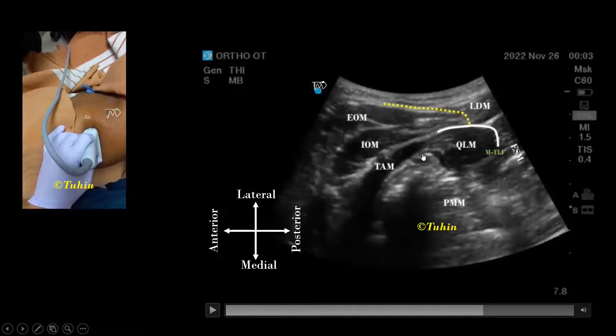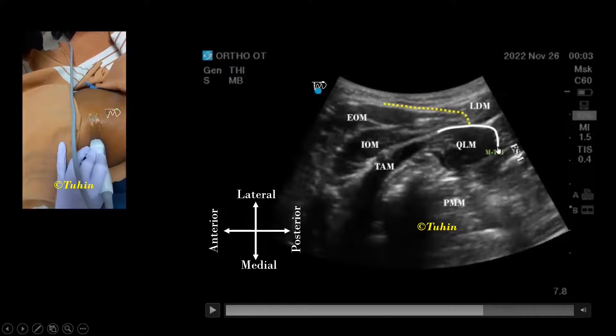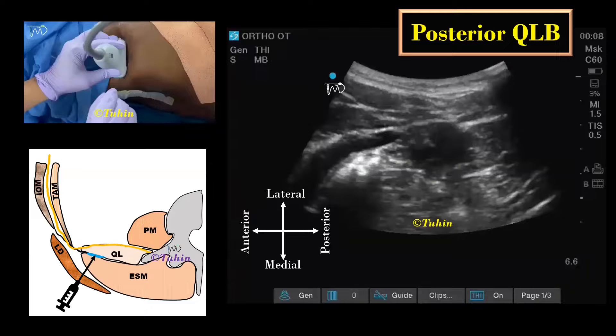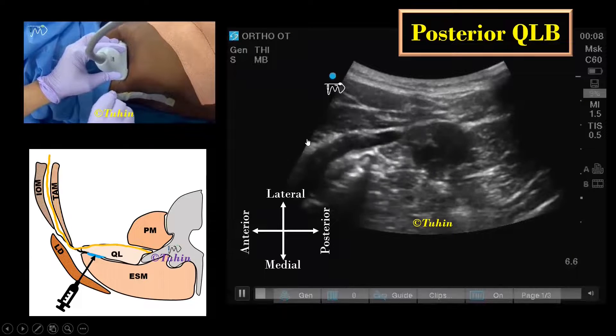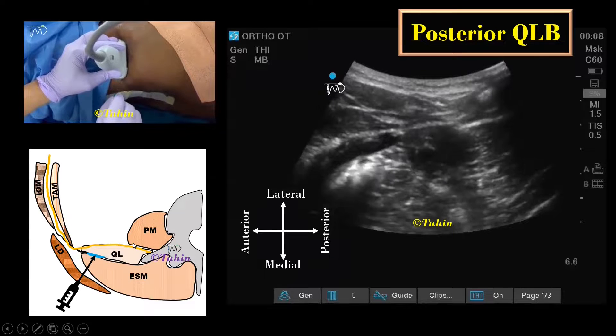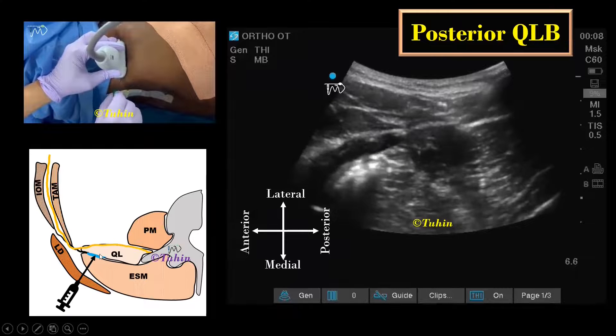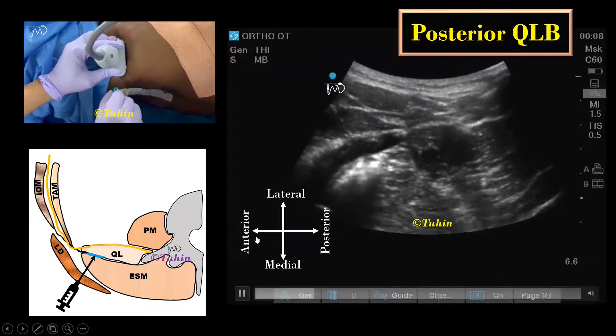The transducer is slightly tilted caudally to identify a bright hyperechoic line that corresponds to the middle layer of the thoracolumbar fascia. The local anesthetic is deposited between the QL and the erector spinae muscles — more specifically, between the middle layer of the thoracolumbar fascia and the epimysium of the QL muscle.